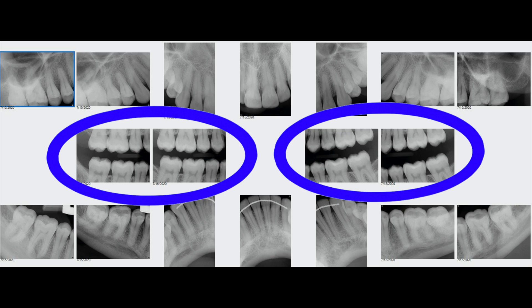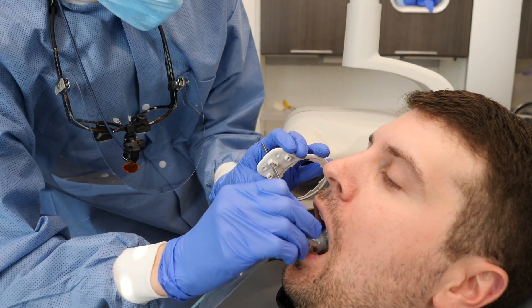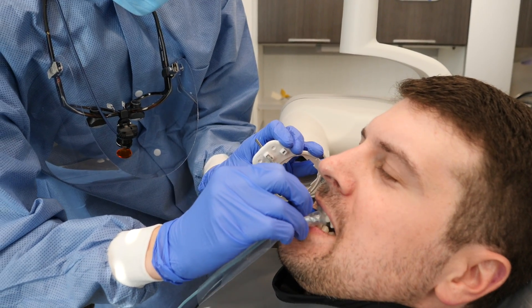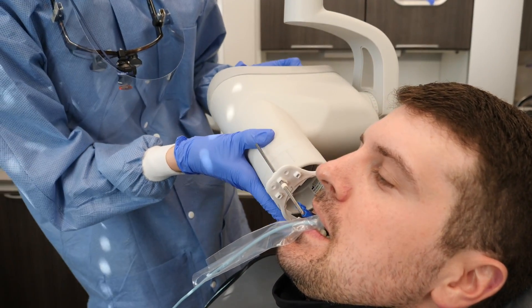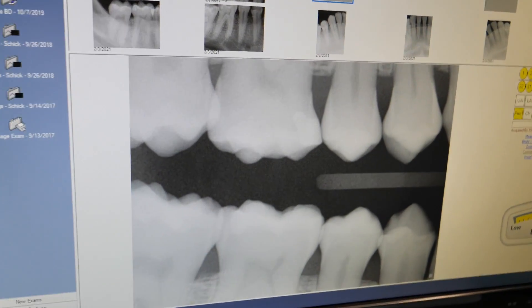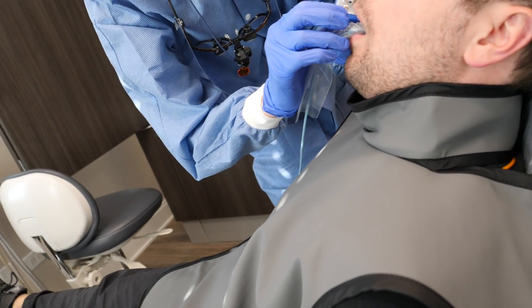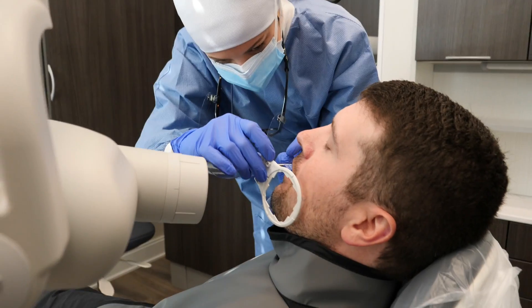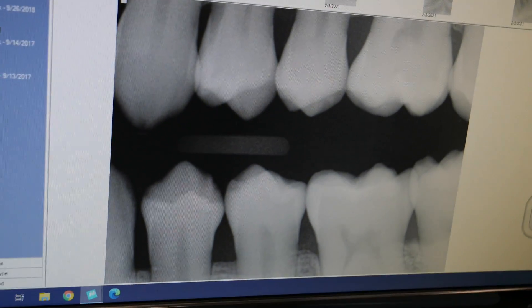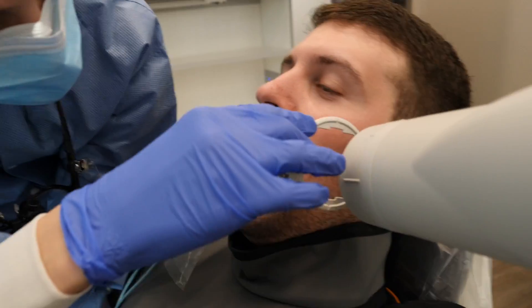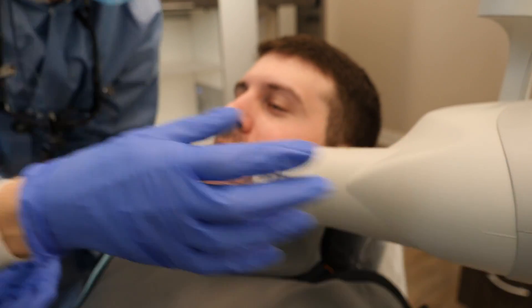Here we are setting up for the bitewings. We're using the XCP rings again, but sometimes just a tab is used without any rings. The bitewings are the ones usually taken routinely on their own, but they can also be included in this full mouth series. The bitewings specifically help screen for cavities and tartar between the back teeth, as well as help examine the level of the bone that holds your teeth in place.